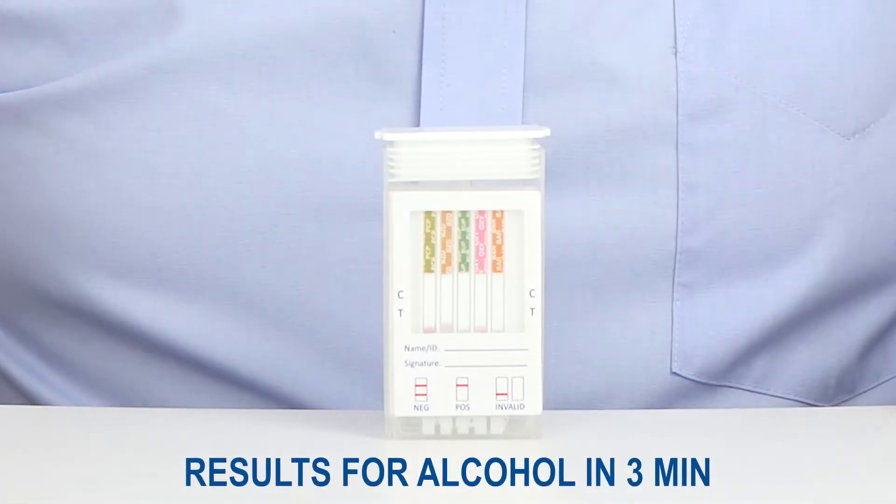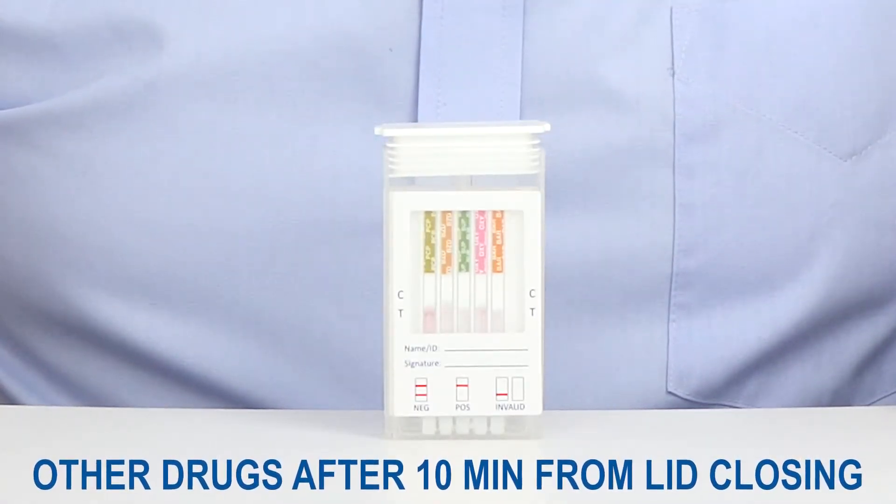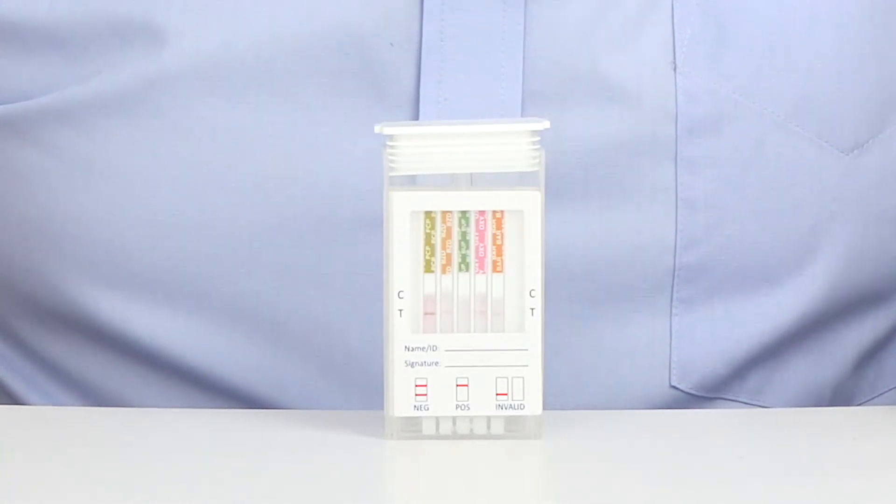Results for alcohol can be read after 3 minutes. Other drugs at 10 minutes of closing the lid of the test tube. Results should not be interpreted after one hour.